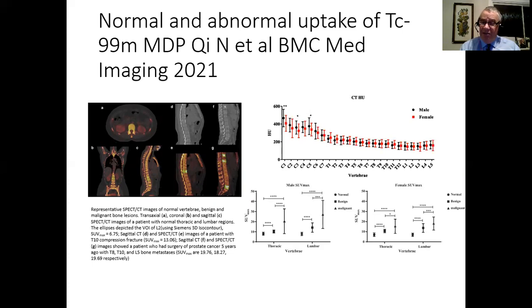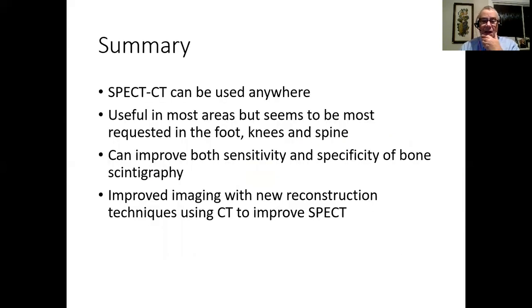Very early research, it needs to be correlated, it needs to be put together, but it is an exciting area which, bone scanning used to be considered something that was a bit boring, it's not as exciting as PET, but with these techniques, I think it's back in the game as actually a very useful and interesting technique.